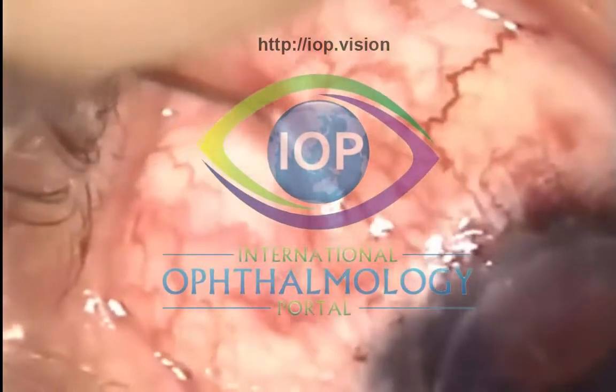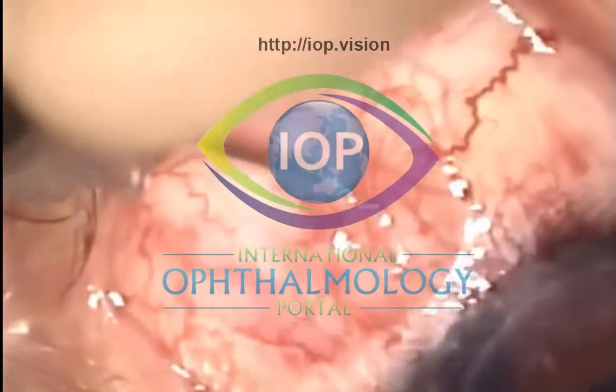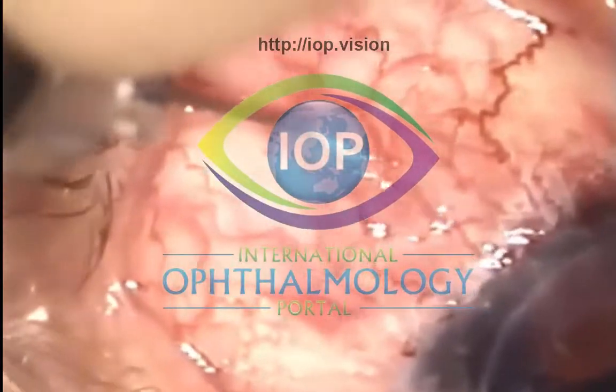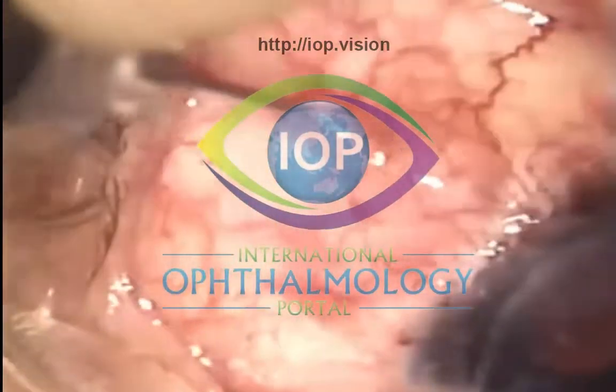I know exactly where the tip is. I'm not going at the moment into the AC. I'm cutting all that scar tissue around the old scleral flap. And you'll now see that the bleb is beginning to form — I finally got into the right plane.